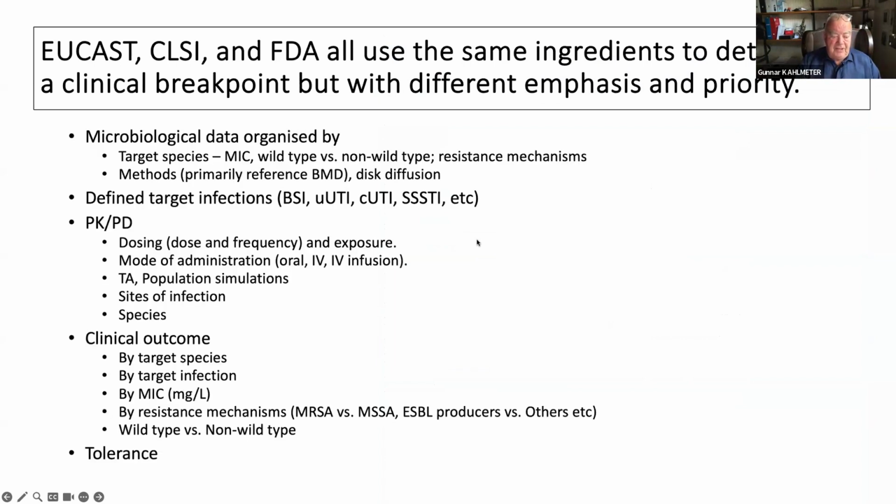CLSI, EUCAST, and FDA all use the same tools for setting breakpoints. It's not so that EUCAST has different tools than CLSI or FDA. And CLSI and FDA have the same tools, but they actually come up with different results. So depending on which agent or which species we are discussing, there might be rather big differences between a CLSI breakpoint and an FDA breakpoint, and between a EUCAST and CLSI breakpoints.